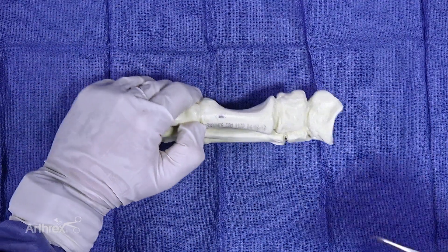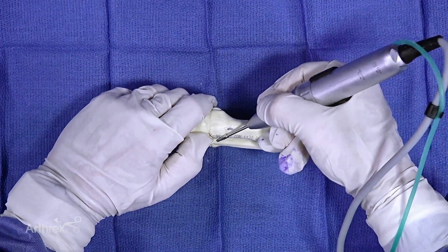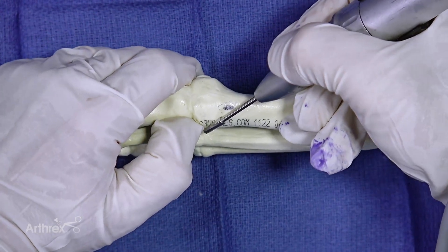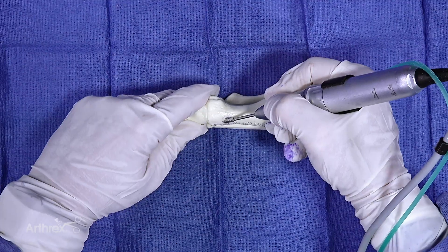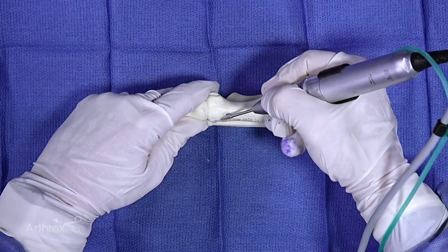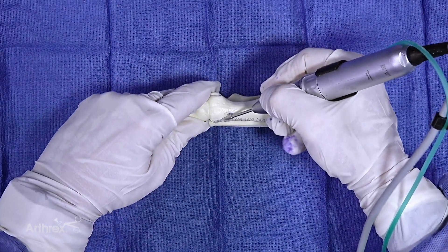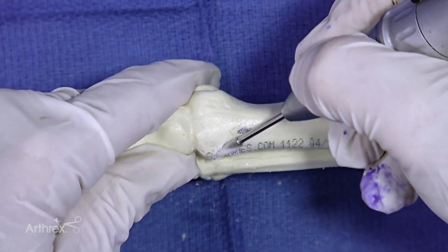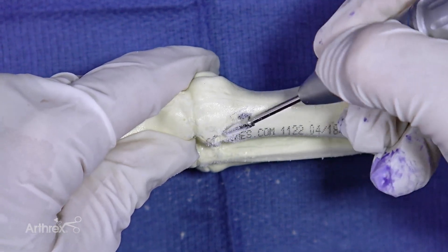So when you're putting in your burr, you can put it in like this and you'll know the extent of your chylectomy using your contralateral hand. You want to basically go in to the wave, so to speak. You don't want to go over the wave.